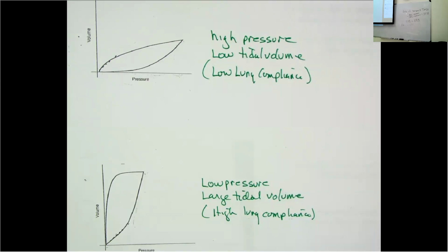All that is pressure right here. But yeah, it's the same thing, and then this is the high elasticity, compliance, and this is COPD and emphysema. Did I have that right? Mhm. Okay.